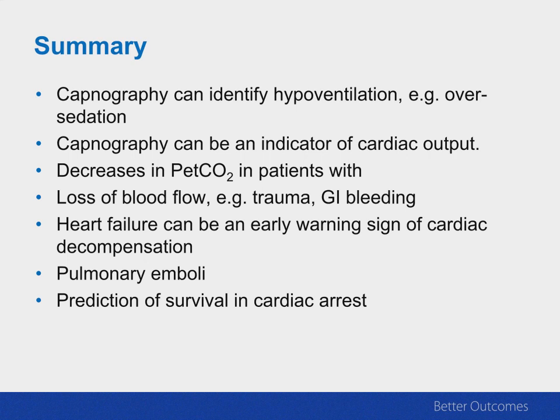And again, just to summarize and stop before I bring Angela on, if I have to look at a capnogram and see with one glance is my patient safe, if a capnogram's reading about 30, I know they have an adequate cardiac output and they're ventilating adequately. There's no other parameter we have that can tell us that much that quickly. So I'm going to turn this back over to Angela, and I think we have some questions. I apologize for some of the technical delays that we had, but we can address those as well. Angela, I'll turn it to you.